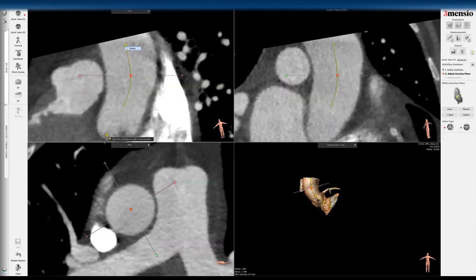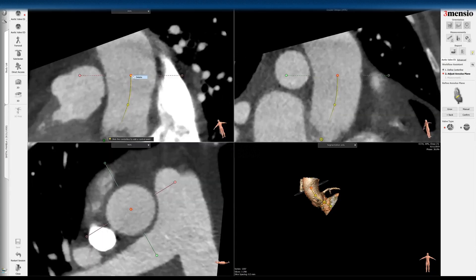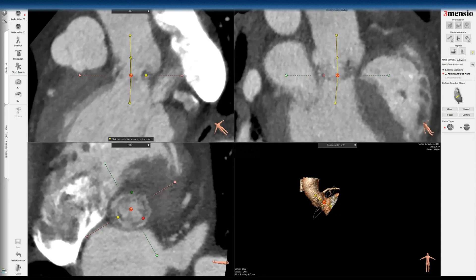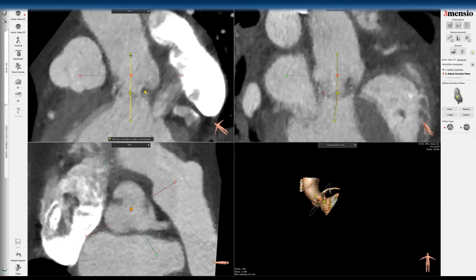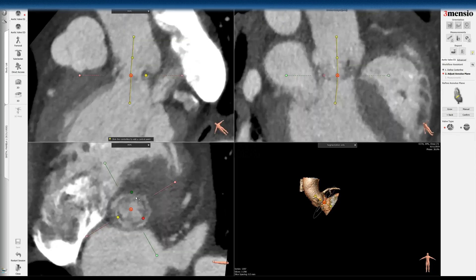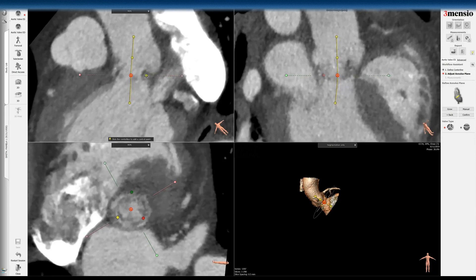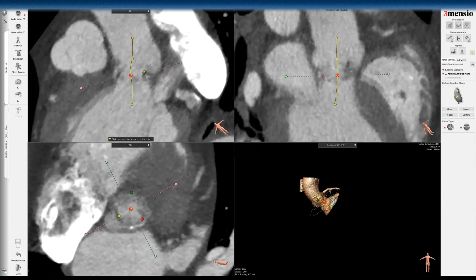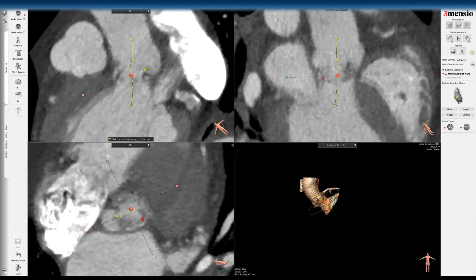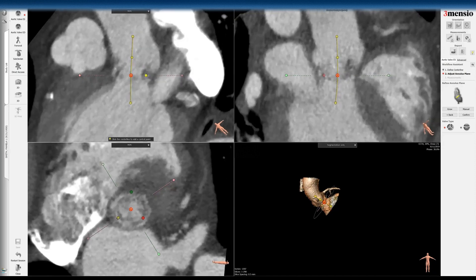The other thing I do with the surgical valve workup is to eliminate these aortic dots to make sure you have a centerline measurement coaxial to the surgical valve. So I'm going to look at the surgical valve — the base of the EPIC BioCore — and try to go all the way down to the base, making sure it's actually bisecting the sinuses, because that's really the only way to tell where the frame is. You can see a faint signature there.